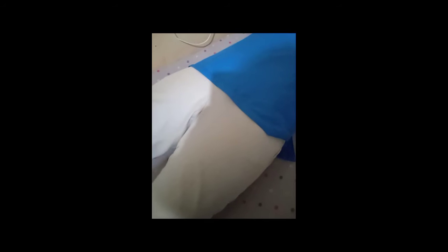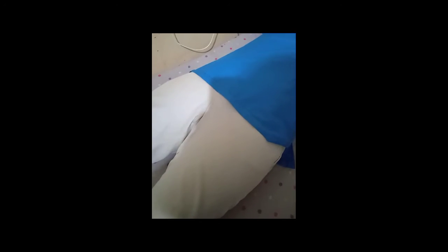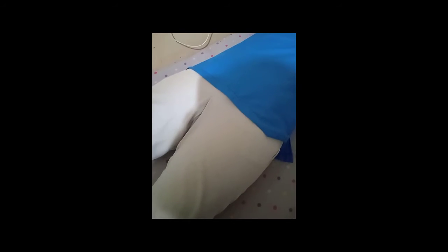Relax lang, ma'am. Okay, so we will now collimate the anatomy of interest. Okay, so we will now proceed to the collimation, but before that, we should not forget to put a shielding for patient's safety.